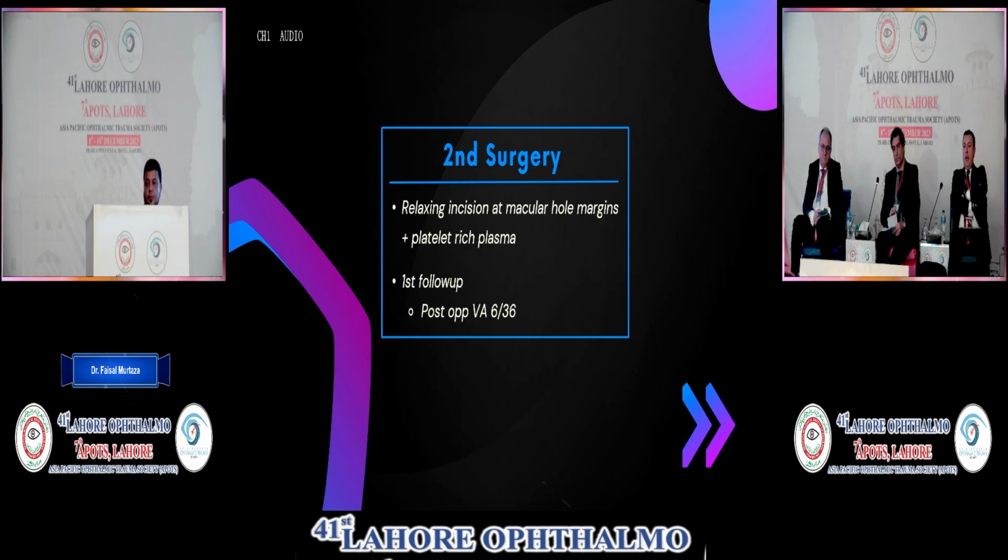Then we planned to do the second surgery. In this we do the relaxing incision at the superior and inferior margins of the macular hole. First follow-up after 1 month, vision was improved.